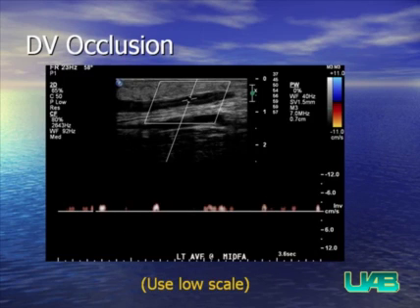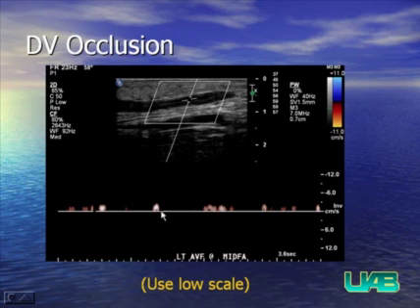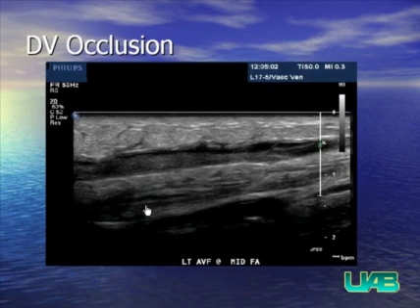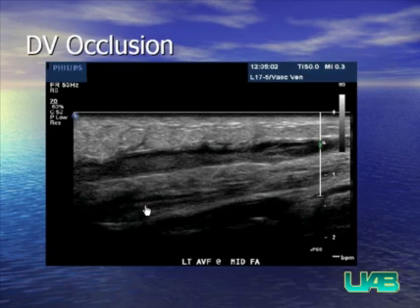Draining vein stenosis should be differentiated from draining vein occlusion. When you have echogenic material filling the draining vein, this is a good hint. Compression will not compress the vein. On spectral gating you may get artifact but no adequate flow. A video clip nicely shows the pulsatility of the clot as it is being pushed upon by the vascular flow.